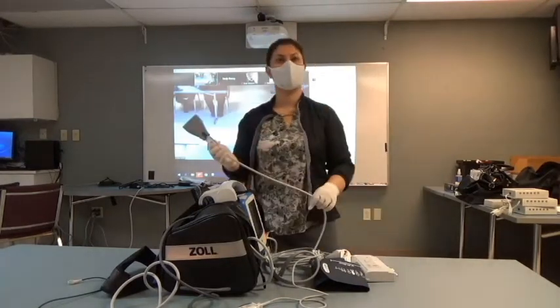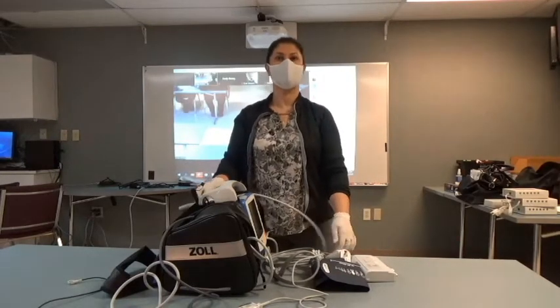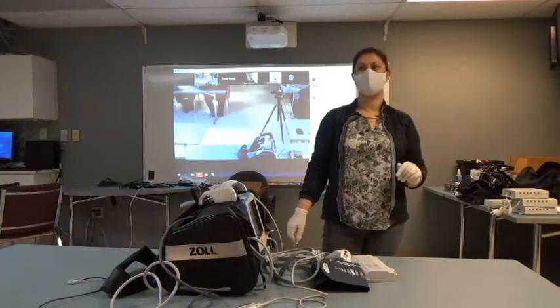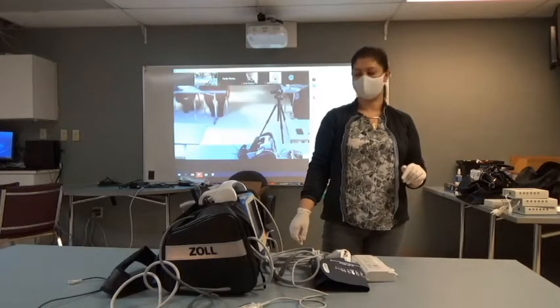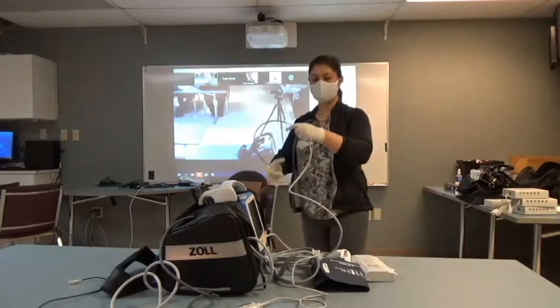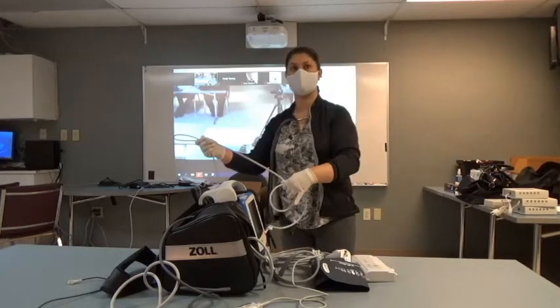Yes? When you're putting it into the test load case, is it supposed to click in or is it just kind of pressure fit? Okay. Yeah, it just fits in. Okay. There's no click. Any questions about your vital signs pouch or your critical care side?